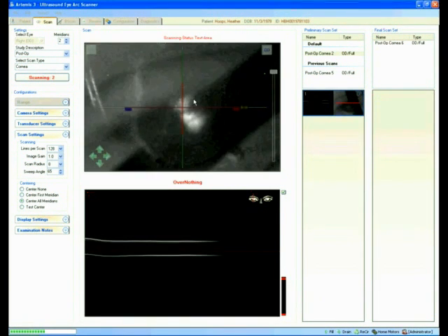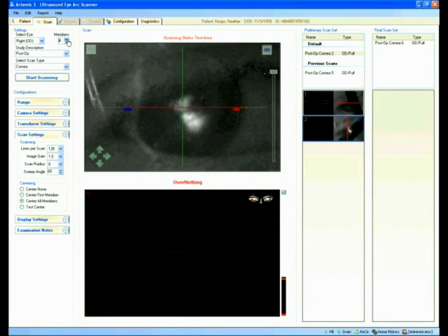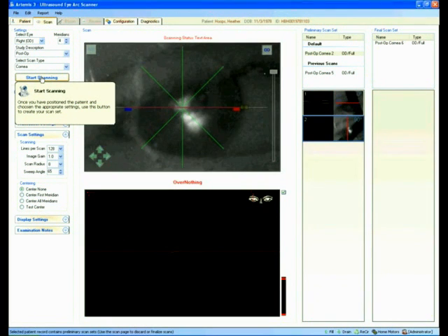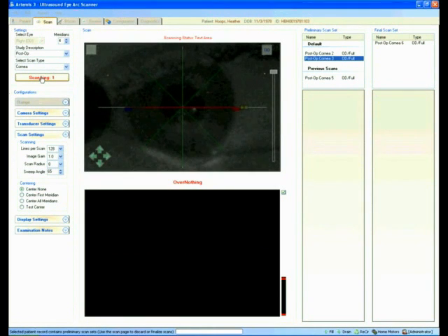That looks good also. Now I'm going to configure it to do a four meridian full scan. When I do this, I'm going to ask the patient to just blink a couple of times, and when I get ready, open your eye and hold your breath.